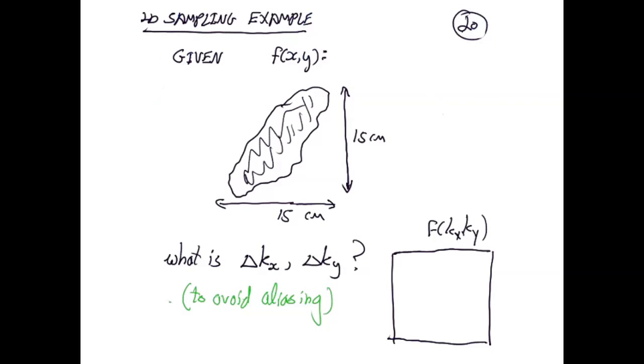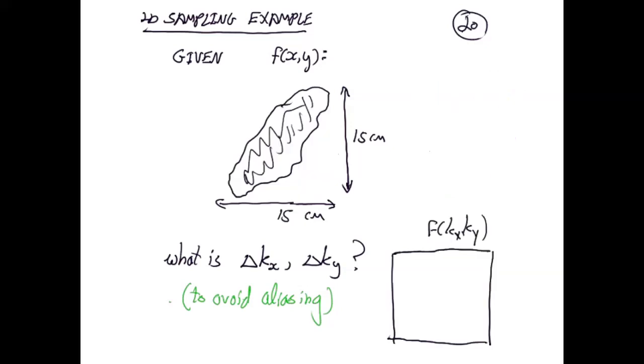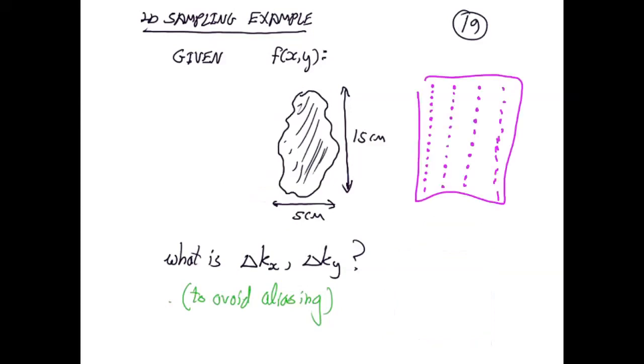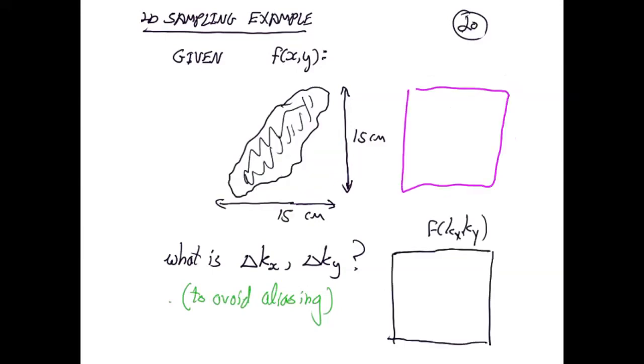If it's 15 tall, you should just be able to get away with something like 1 over √2 times 15 if it's at 45 degrees. Well, look at this case, right? In this case, I sample it that way. And now it's just rotated. So can't I just rotate my sampling? I could rotate my sampling. So effectively, not sample just regular delta X, but actually sample more finely across the diagonal.